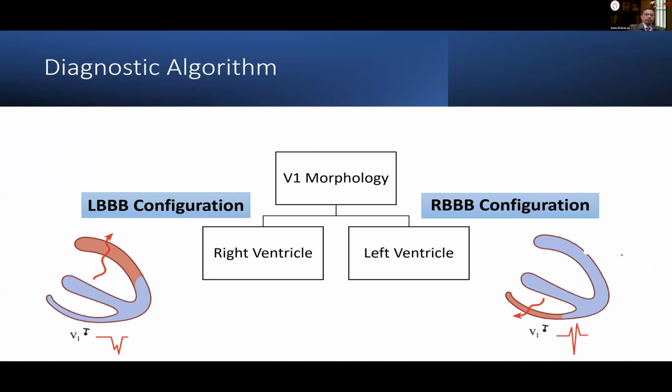If you have the ventricular arrhythmia with left bundle branch morphology, which shows here in V1 a QS pattern, then it means that the origin is from the right side going to the left side. While if you have the right bundle branch morphology, if you look at here, V1 is an R pattern, and the possibility is that the origin of this ventricular arrhythmia is from the left ventricle.